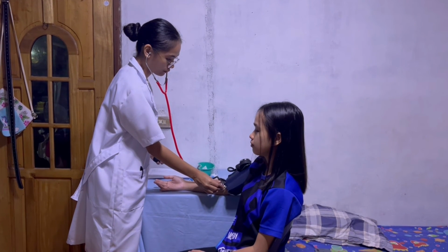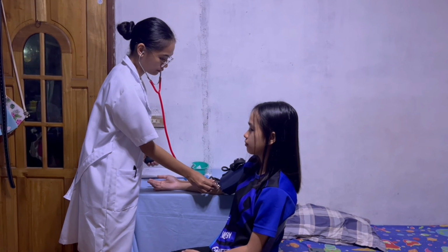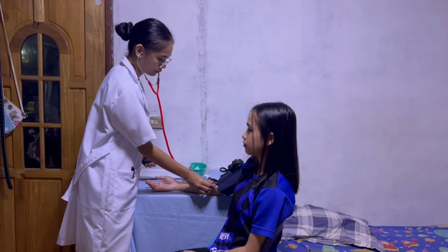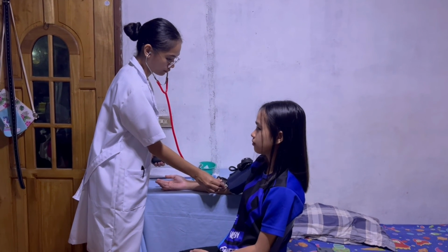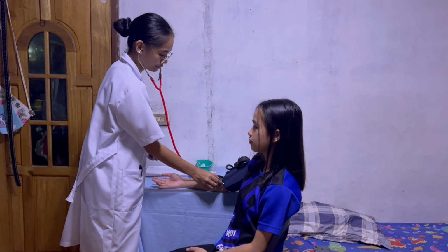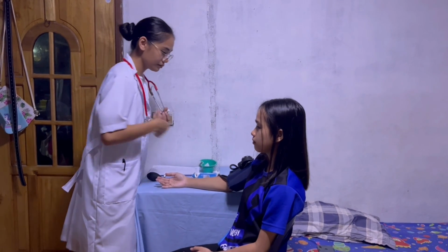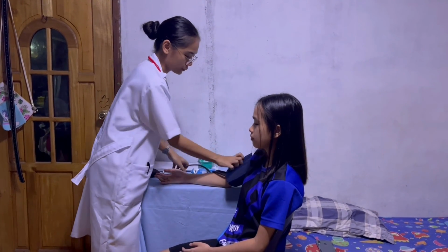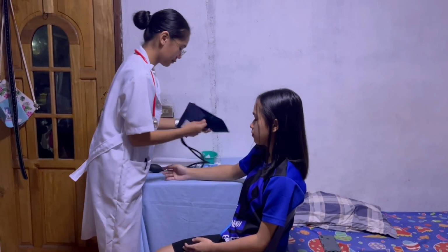Pump up the cuff until the sphygmomanometer reads 30 mm of mercury above the point where the brachial pulse disappeared. Slowly release the valve on the cuff carefully. As the pressure falls, note the point on the manometer at which you hear the first and the last sound. If it's the client's initial examination, repeat the procedure on the client's other arm. Compare the blood pressure reading with previous readings and look for a corresponding change in pulse rate.